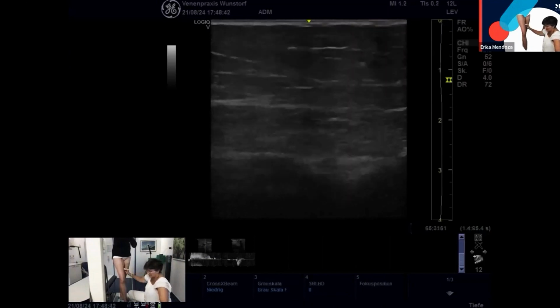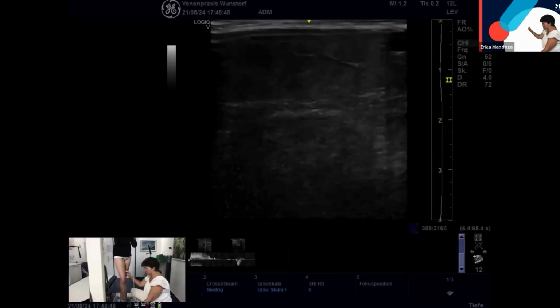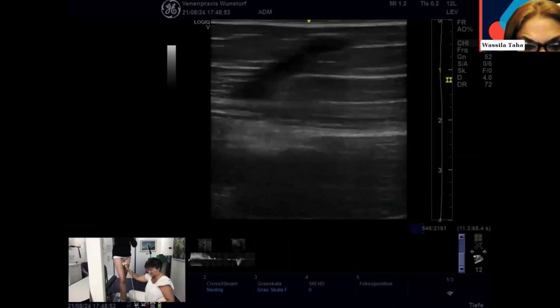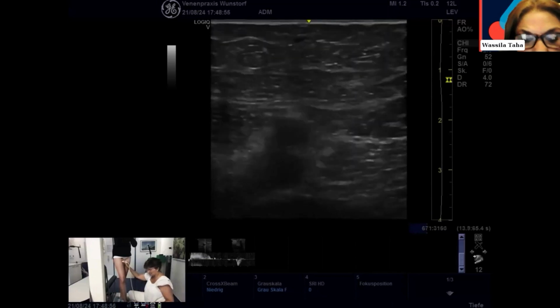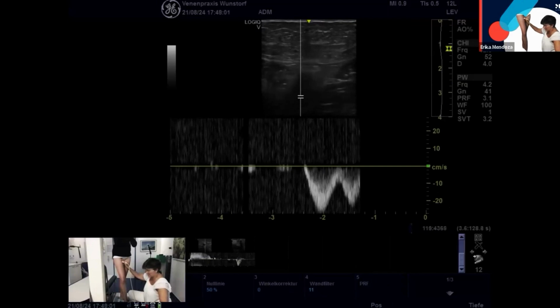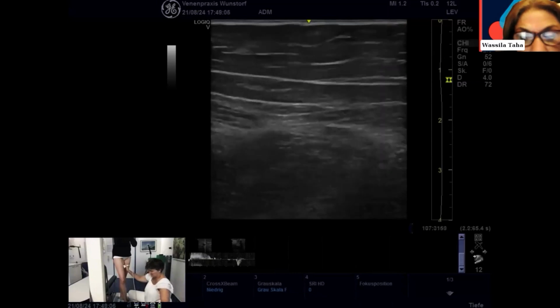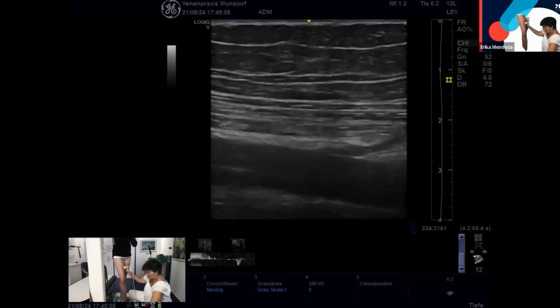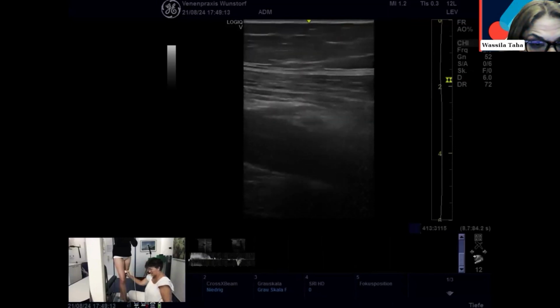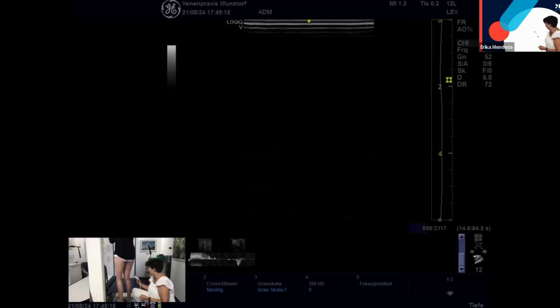The valves are really perfect. I cannot see scars, but we can elaborate thoroughly with the B mode. This is the answer for the hemodynamics, so there is no deep vein reflux. What about remnants of the old phlebitic changes? We cannot see them. No post-phlebitic changes. So I will work with the medial vein.